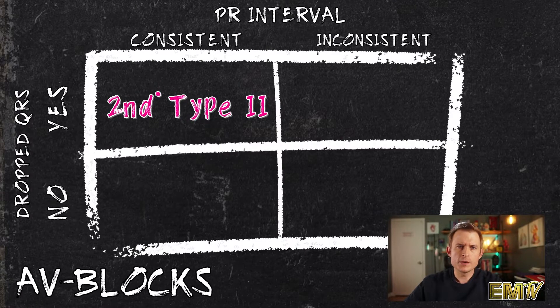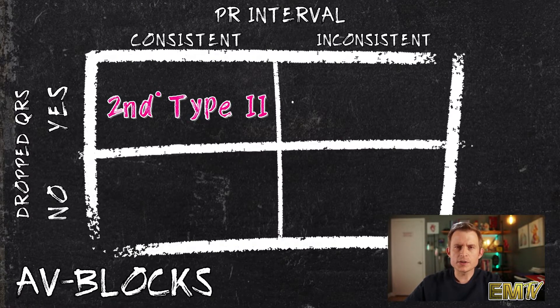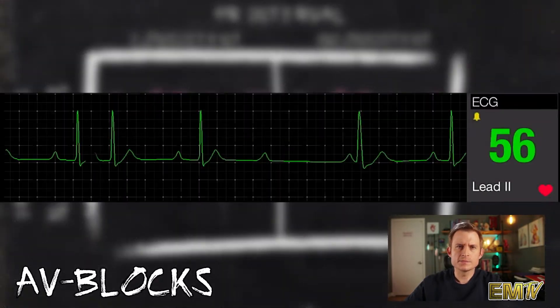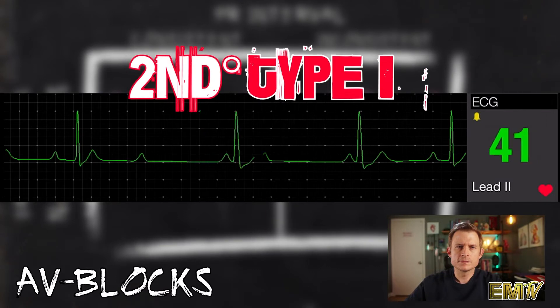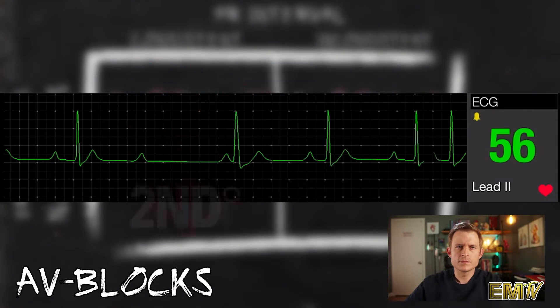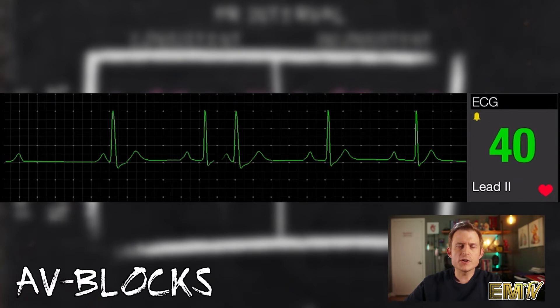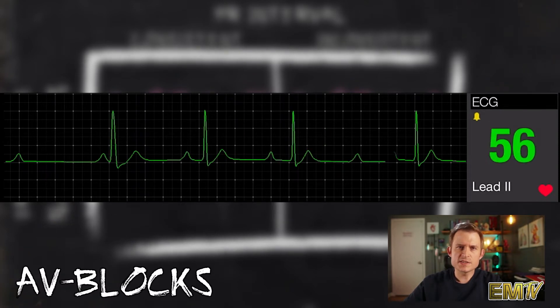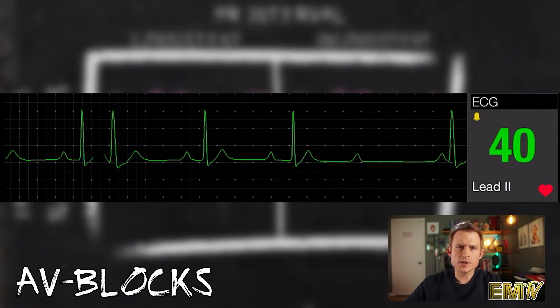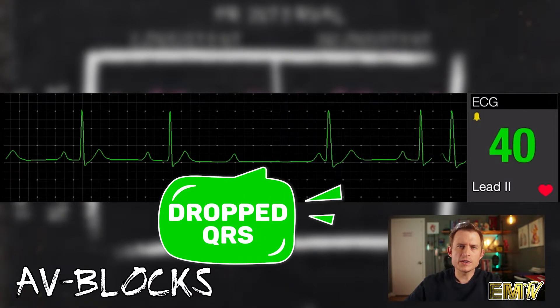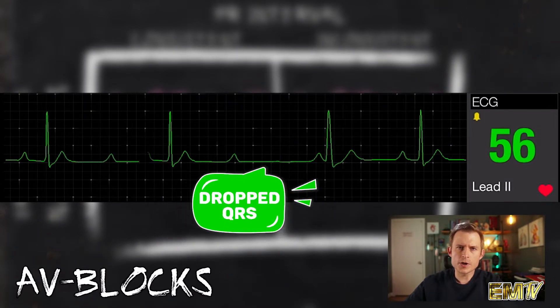For the top right corner, a rhythm with an inconsistent PR Interval and a drop in the QRS complex is the second degree type 1. As you can see, the PR Interval here is inconsistent and there's a drop in the QRS complex. Second degree type 1 rhythms will often follow a pattern of a lengthening PR Interval before the drop.